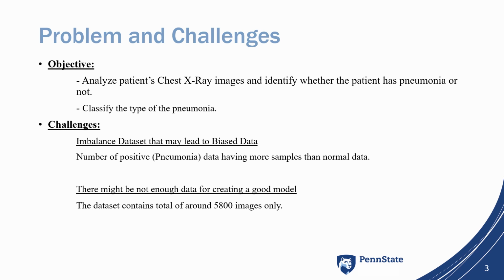And here are some of the things that are the challenges of our project. The first one is the imbalanced data set that may lead to biased data. The data set that we have is imbalanced, with the number of positive or pneumonia data having more samples than normal data. This may be a problem and may introduce bias in the classification.